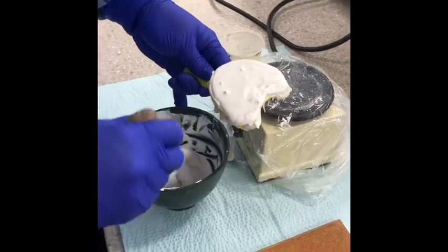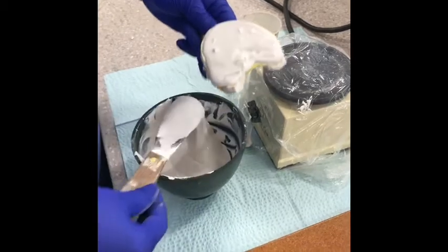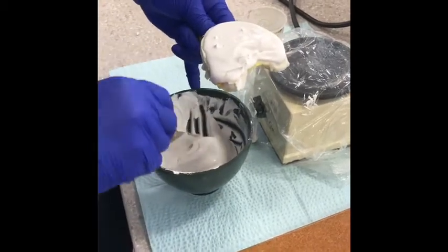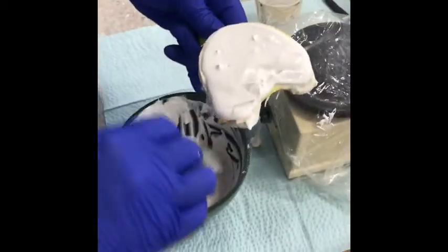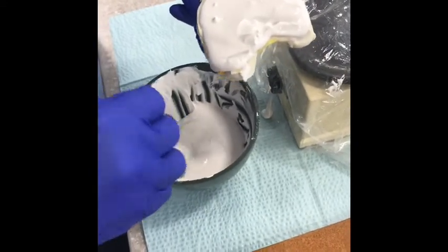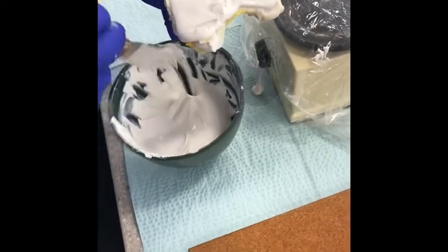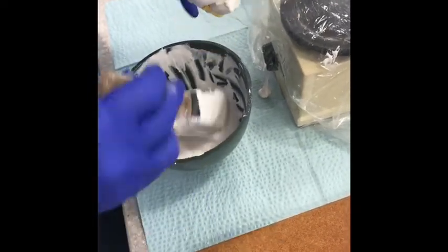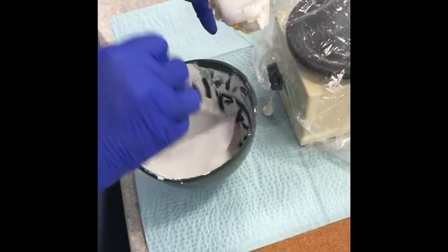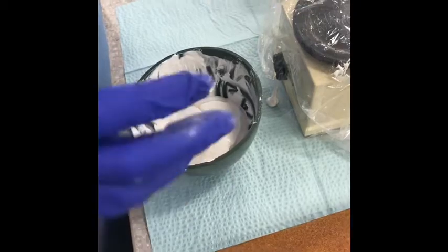We've mixed up our plaster and poured up our impression. The plaster is white and actually much more porous. The ratio is 190 grams of powder to 100 milliliters of water — much more water than for stone. The plaster is also a lot more fragile, so when you separate the impression from the model, you want to be a little more careful.